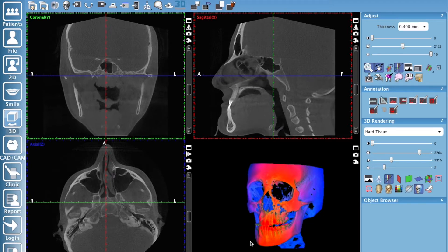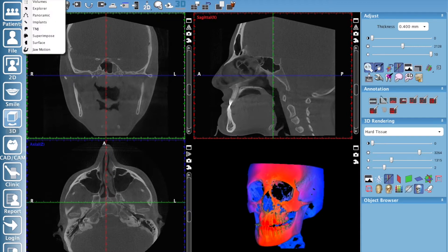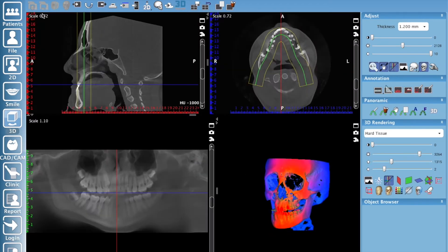As you know, when you open up a volume you are in the Explorer sub-module. We're going to click on our sub-module menu here and go down to Panoramic. Now in the panoramic module you have your sagittal view, your axial view, and your pseudo pan here.